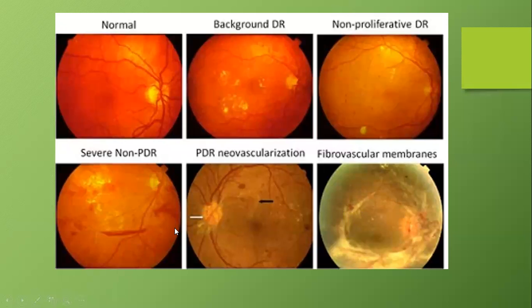What is important here is that you are not required to differentiate between non-proliferative and proliferative diabetic retinopathy. What we expect is that you see that there is diabetic retinopathy going on, and you refer this patient for further evaluation by an ophthalmologist.